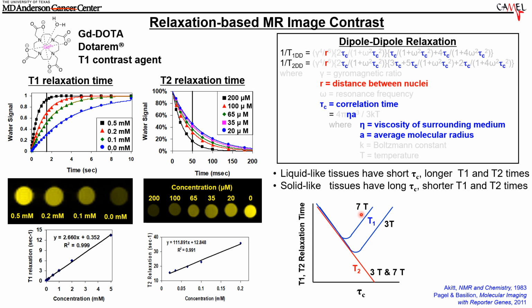And that can be surprising at first. A clinical radiologist will be used to the type of image contrast in a clinical magnet, and then you'll show them images from a small animal magnet on a mouse model, and it will be disconcerting because they're not used to that kind of image contrast. In general, T2 weighted contrast works well at 7 Tesla, while T1 weighted contrast works well at 3T due to this effect right here. And I'd like to refer to these two references for more information.